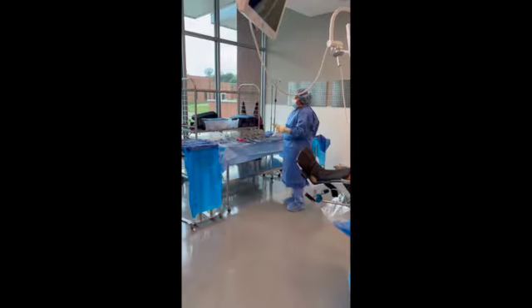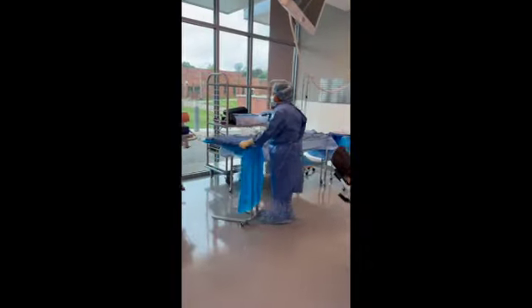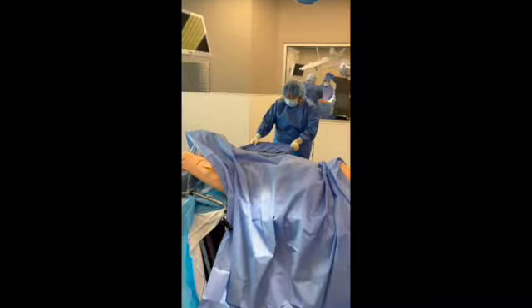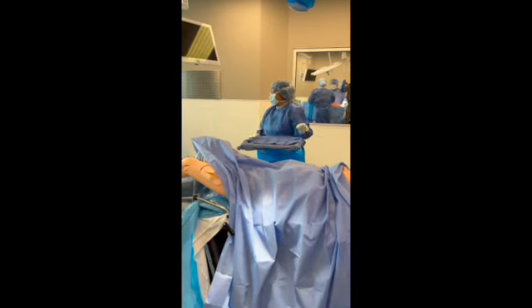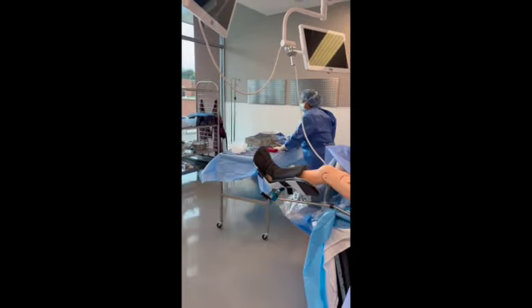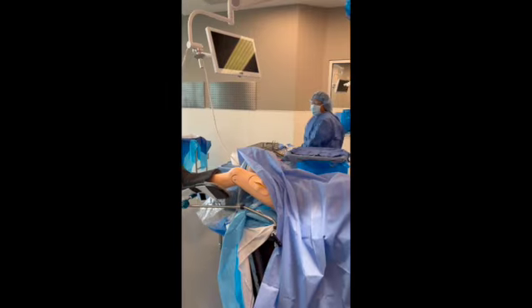All right, this is where the tables will be set up preoperatively. So I'm going to go ahead and move on to where they will be during the surgery. We're going to have the Mayo stand over the patient. And then we are going to put the back table right in front of the man standing next to the patient.